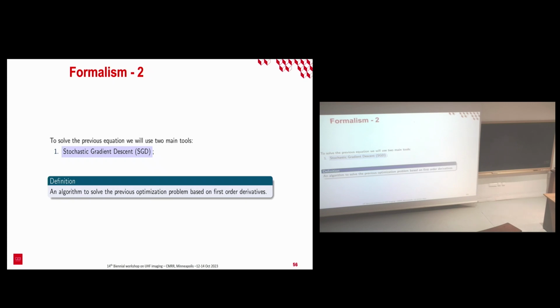So we need an optimizer, basically an algorithm that allows us to optimize. And we're going to use stochastic gradient descent as an algorithm, because usually in machine learning you are not able to load all the data simultaneously, so what you do is subsample the data space and do gradient descent. This is why we call this kind of algorithm stochastic, because you subsample the data space. It has good convergence properties, and there are some refinements in the deep learning frameworks, notably Adam or Rectified Adam and so on.